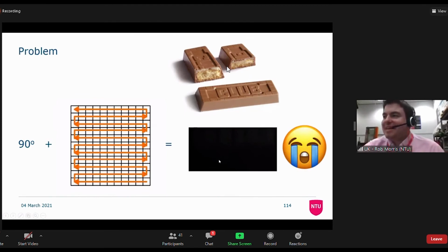The second problem is when you want to do these wonderful fast imaging sequences, which I've showed you, and you have samples that are tasty, like this club bar, which I had for my lunch today and tried to image. And if you image it with the fast EPI sequence, you get absolutely nothing. The scanner wouldn't even set itself up. It had to have a bottle of water next to it so it could set itself up with the water, which I've cropped off. But this is the actual image which I collected of the chocolate bar.